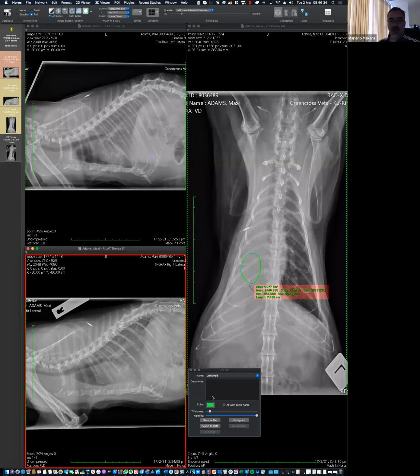And we had a paper that we showed that with one of my residents in Sydney. Then if we turn the animal the other way around, it's not going to take 5 hours. It takes 10 seconds. Again, there's going to be a partial atelectasis, mild, but enough to challenge your visibility of the vessels or a focal lesion that will be there. That is a phenomenon that happens relatively fast.